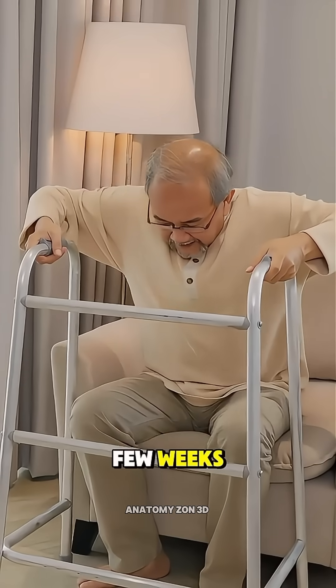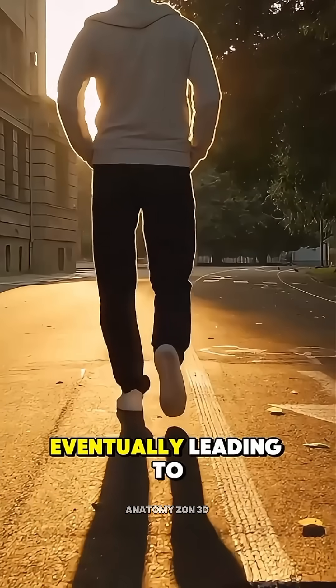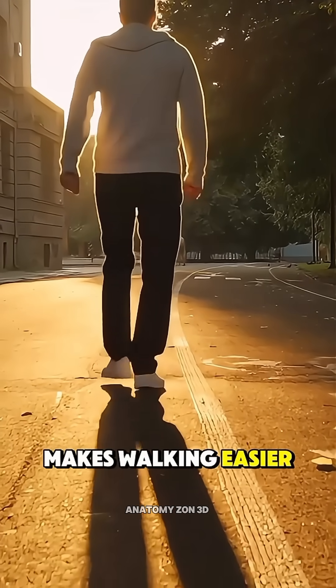Over the next few weeks, patients keep weight off the toe while the bones fuse completely, eventually leading to a pain-free, stable joint that makes walking easier again.